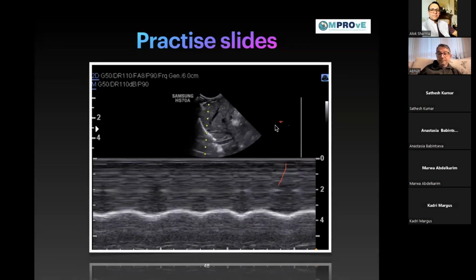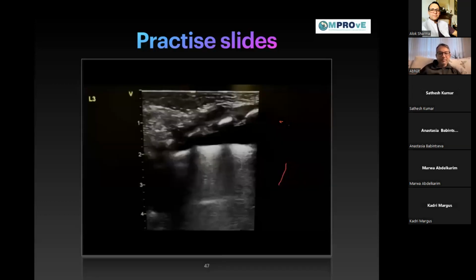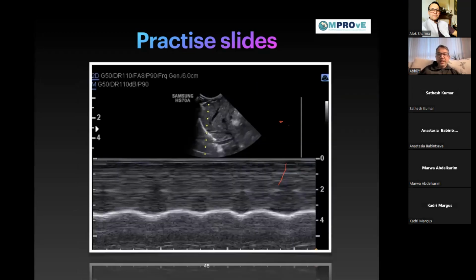Yes, I'll cover it in the talk on pleural effusion. Don't worry. Okay, there you go. Alok's going to give you that one. But just to give you a one-statement answer, yes, you can measure the pleural effusion. It's a very simple technique: how much is the fluid volume there? And depending on the respiratory status and the clinical background of the baby, you end up draining that effusion. But I'll leave that with Alok.